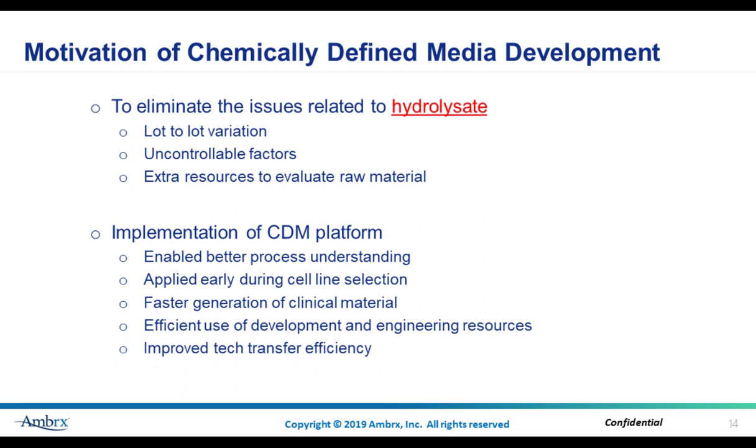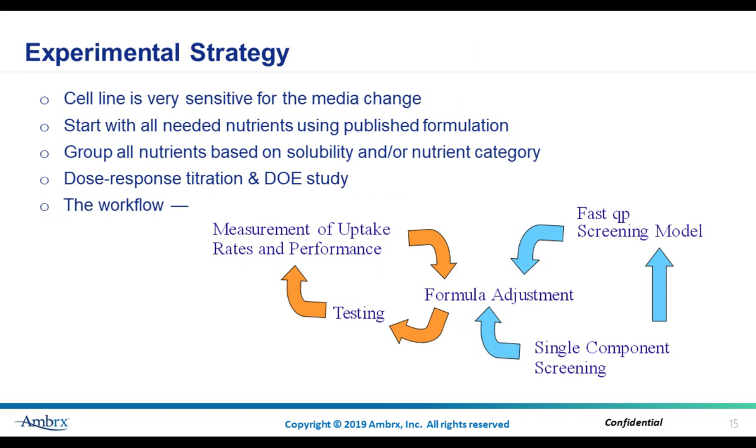Nowadays, using chemically defined medium has become the standard in the biotech industry. Here are some of the motivations for why we need to develop chemically defined medium. These motivations are pretty well known now, so I won't read through all of this. But next, I would like to share some experimental strategies.